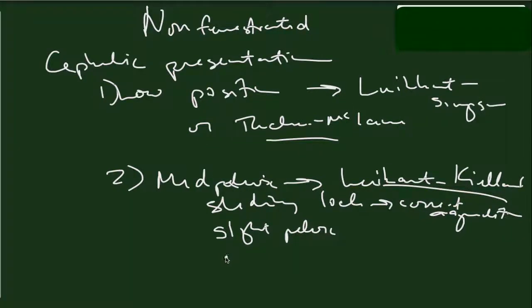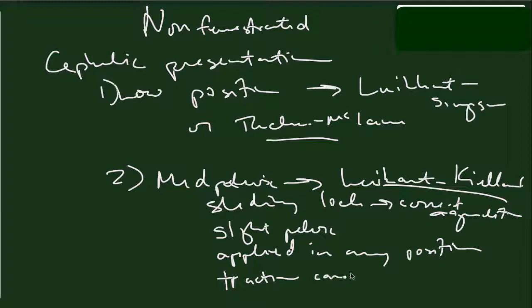They can be applied in any position, and traction can also be accomplished in any position.